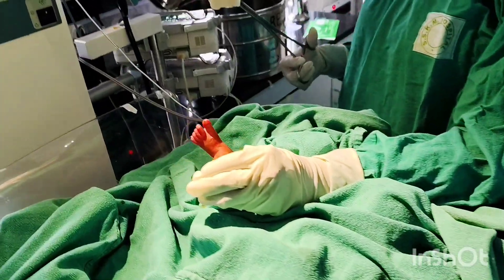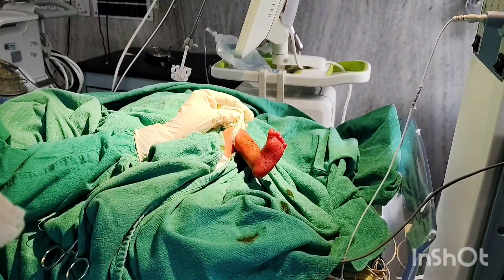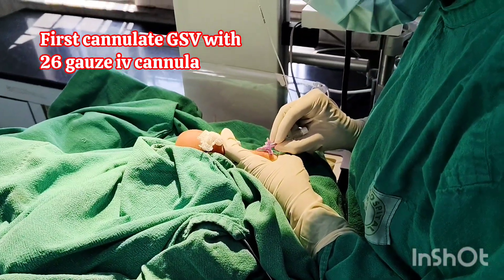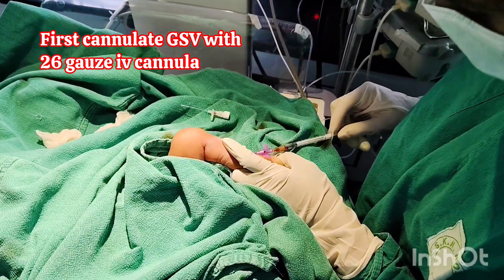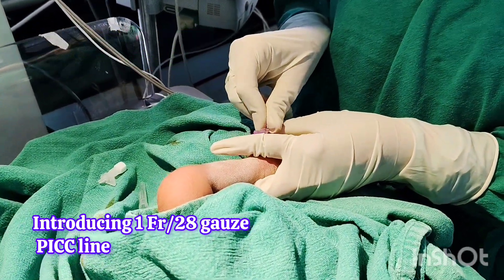Here we are doing dressing and draping of the left lower limb before insertion of the PICC line in the left great saphenous vein. First, I am doing peripheral cannulation in the great saphenous vein with a 26-gauge cannula, so that I can introduce the 1 French PICC line through this cannula.